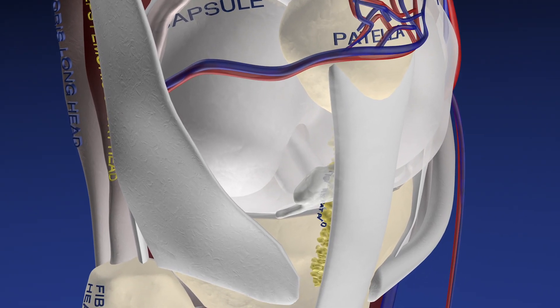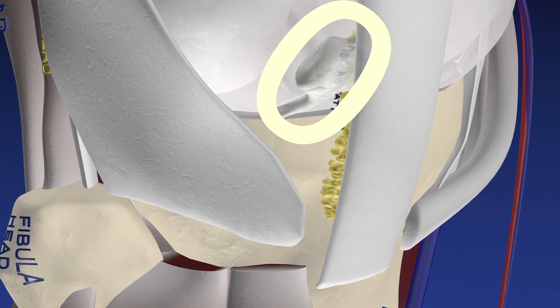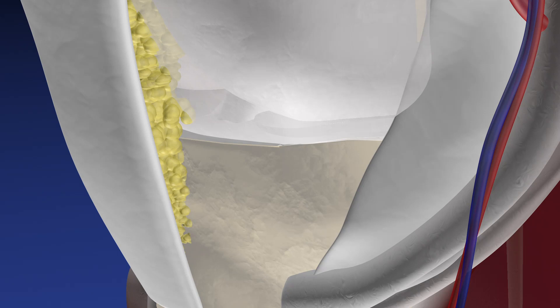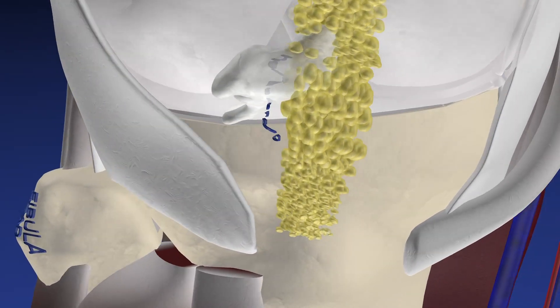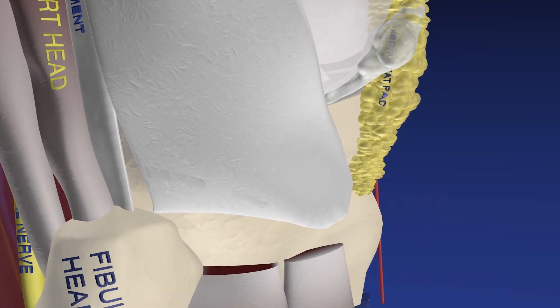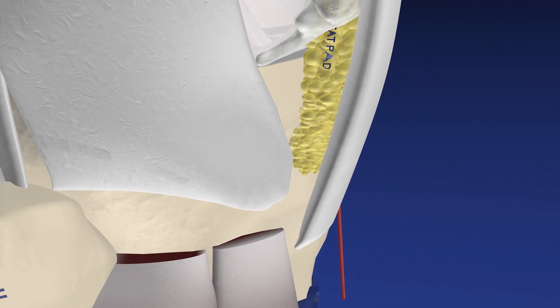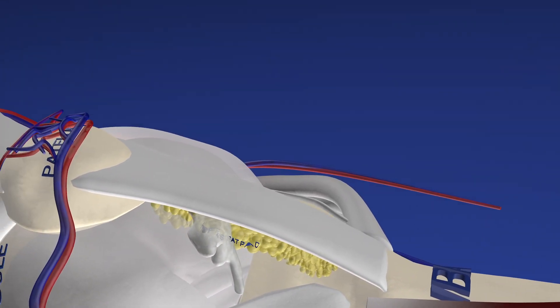Here we are focusing on the Hoffa's fat pad. You can see this ganglion, which is sitting essentially within the fat pad and somewhat lateral to it as well. Here's the medial aspect of Hoffa's fat, where you do not see the ganglion. And now with the patella tendon removed, we can see this very irregular ganglion with somewhat of a stalk or communication track inferiorly going into the joint, which we're focusing on here.